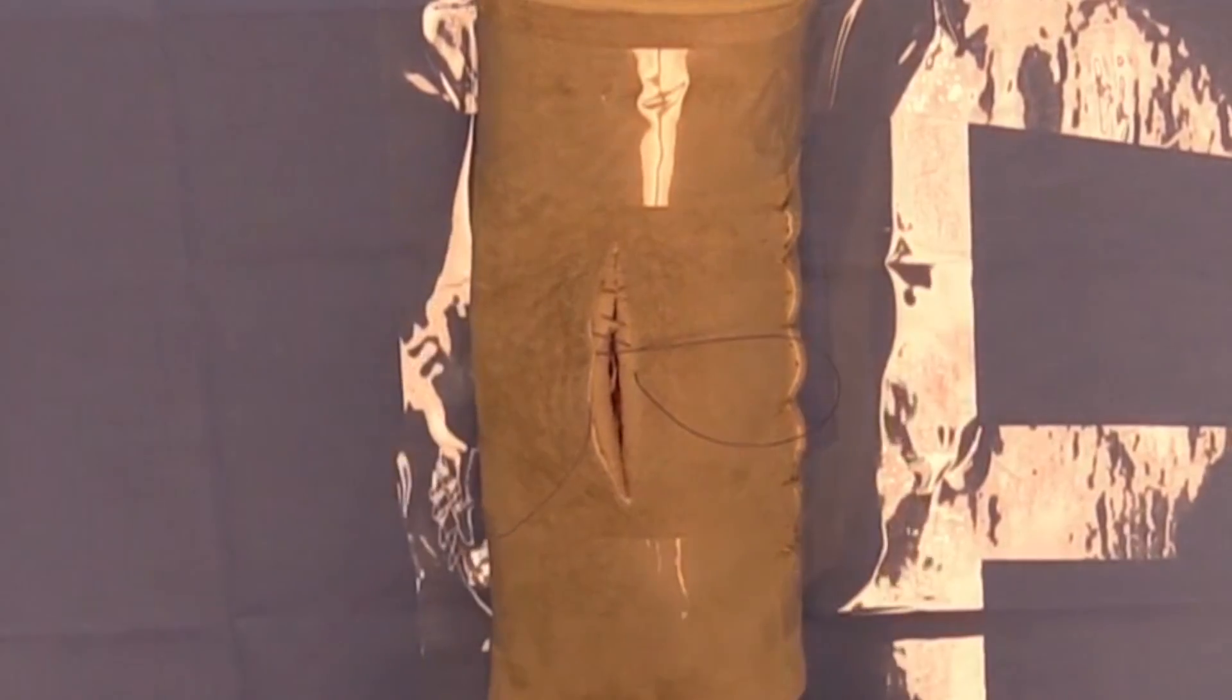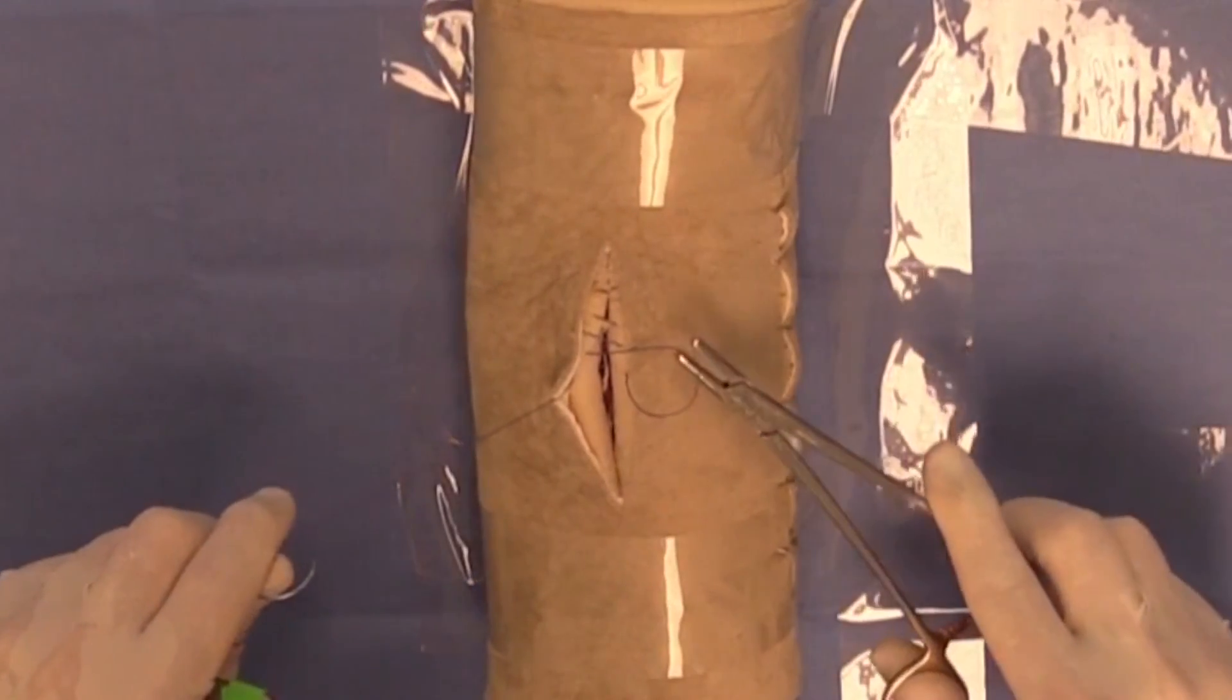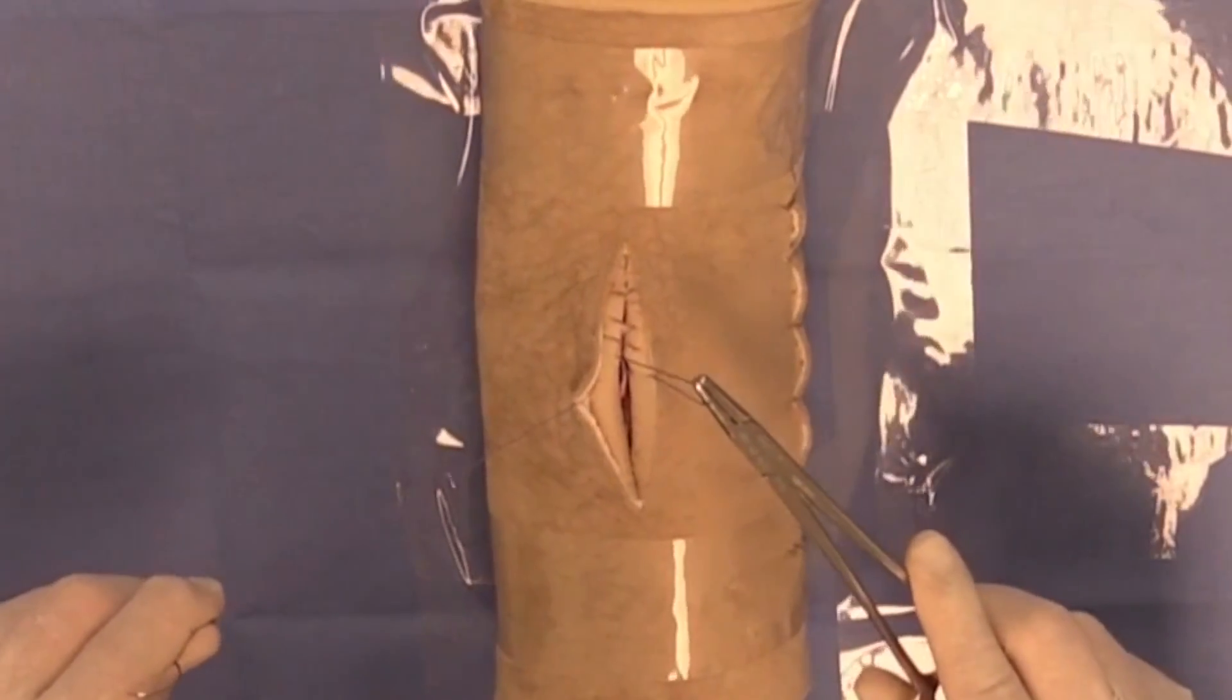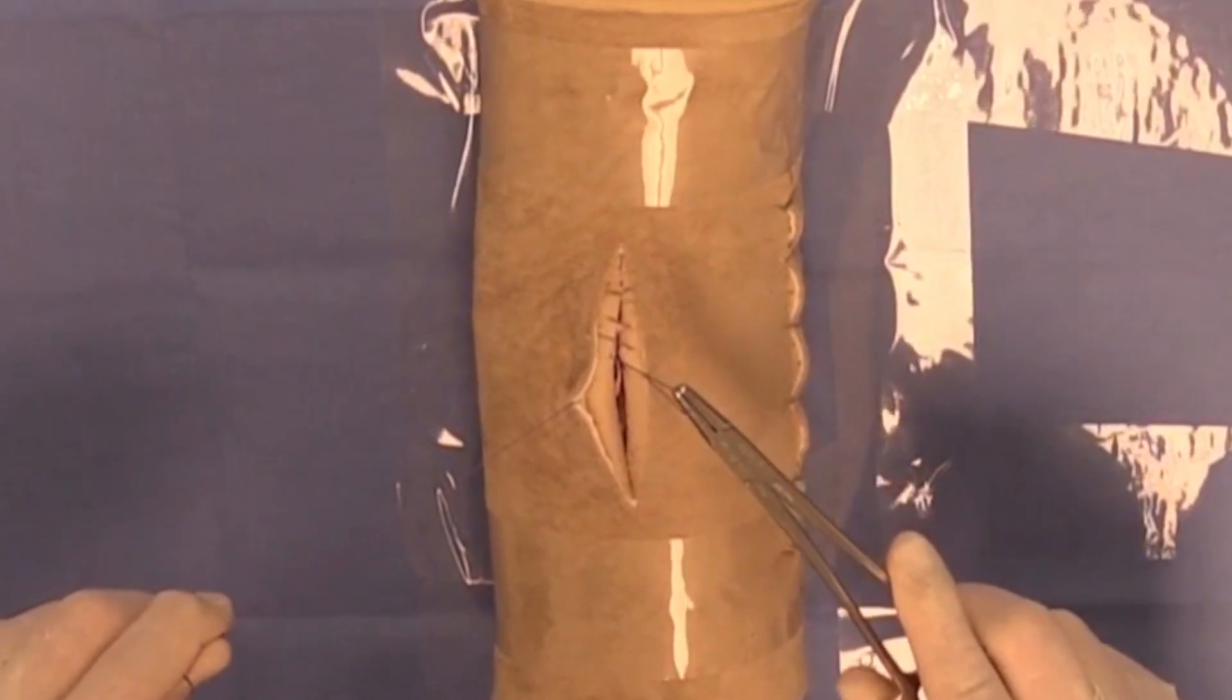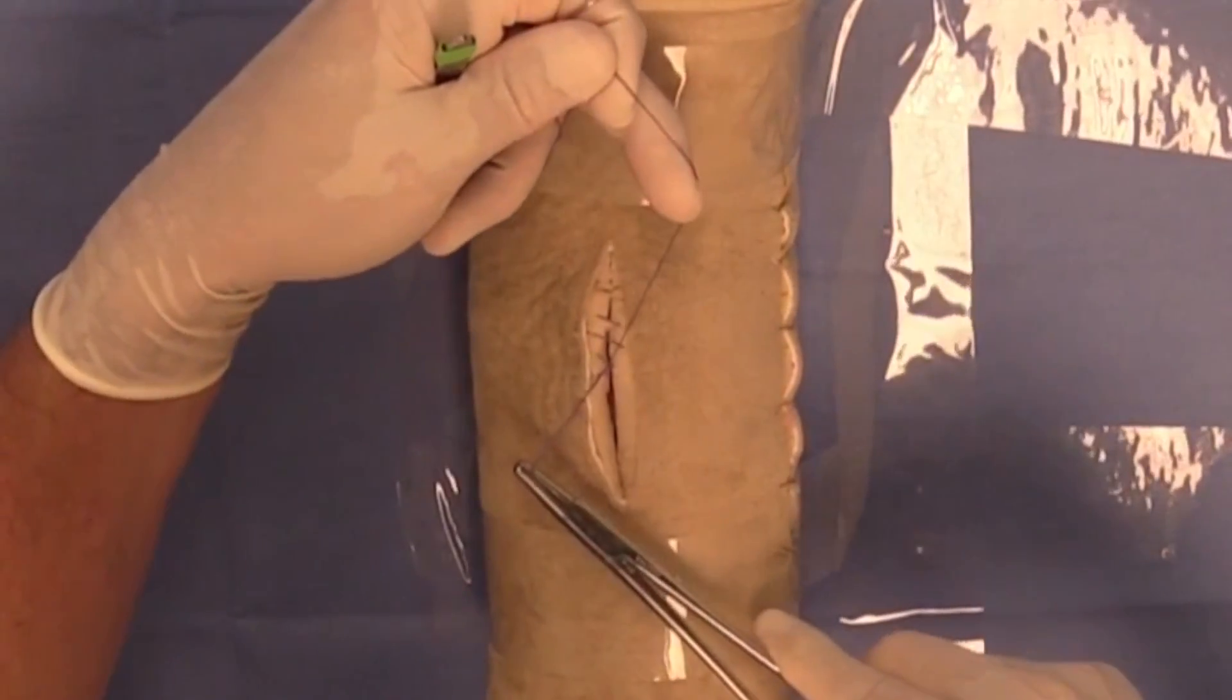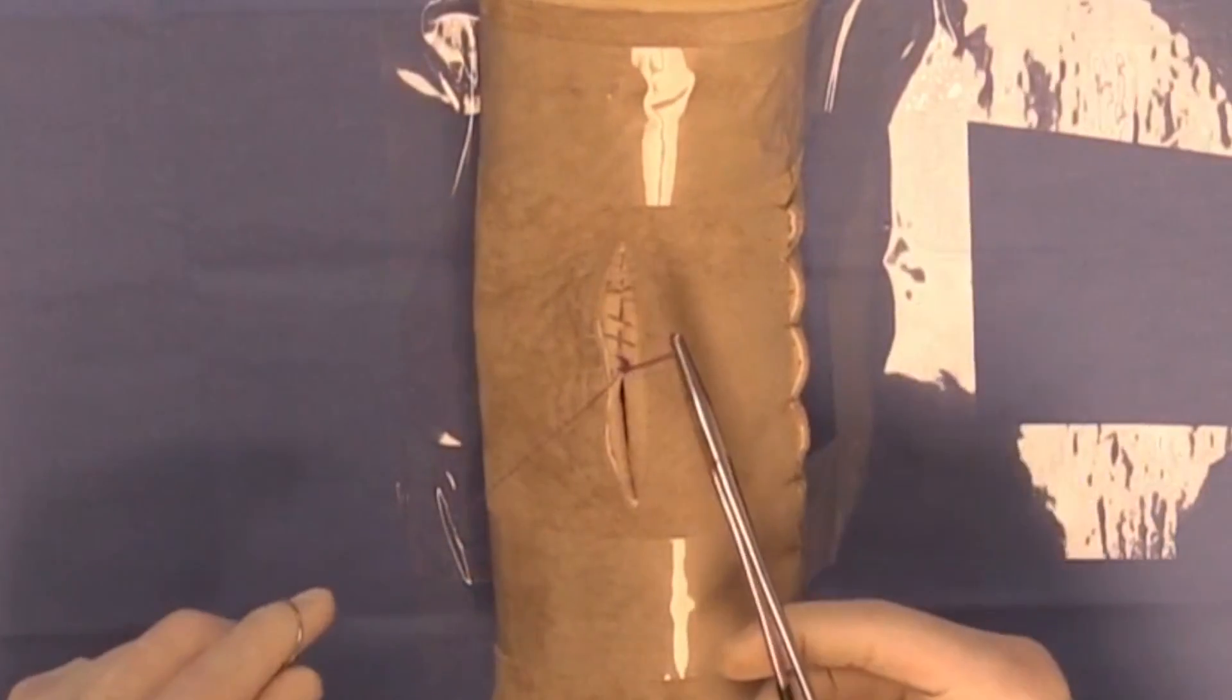For this course you should try to develop a gathering technique and then a proper method to end a continuous suture pattern by tying back to your last loop. If you do that technique you'll notice that your knot then ends up obliquely across your surgical incision which is proper.